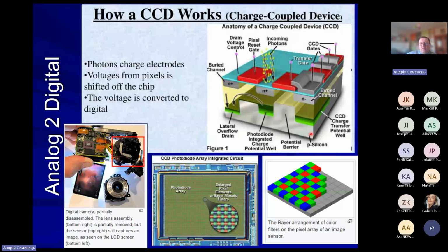Again, what a single CCD device unit does is, in response to illumination by some external energy, generate some electrical current.